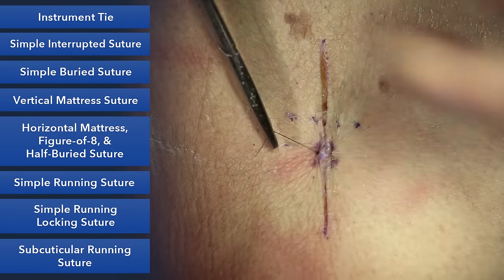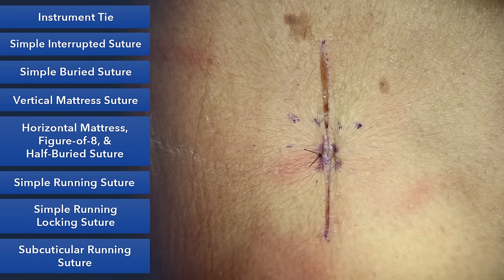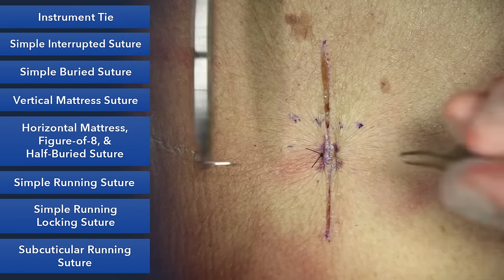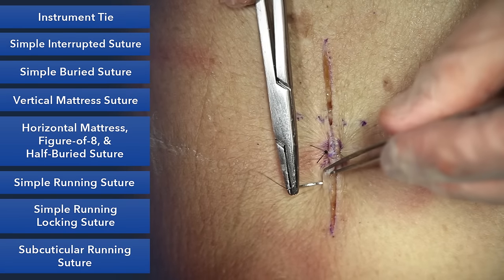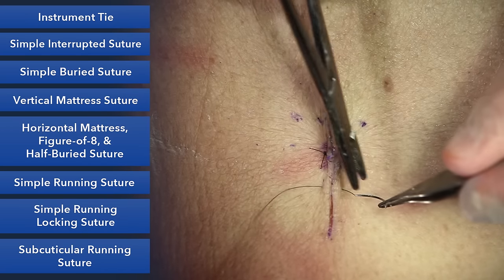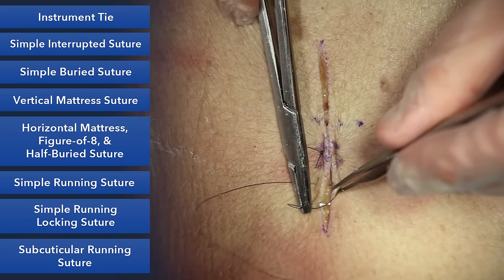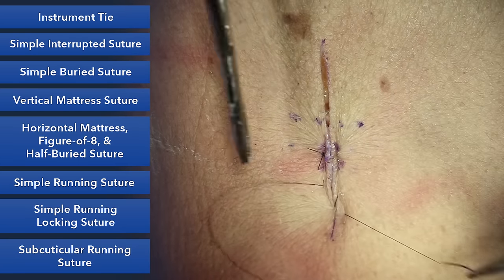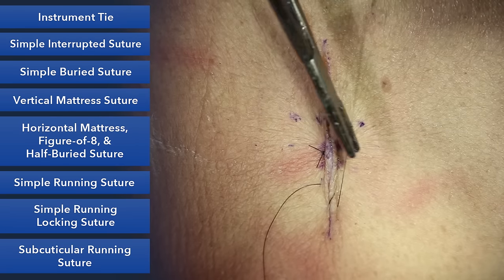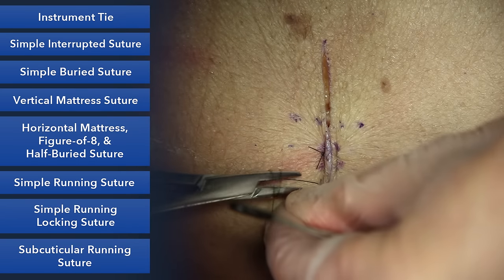So that's one example of a horizontal technique. A variant of this is the figure of eight suture. The figure of eight suture is the same distribution. You take your simple bite and your simple bite, but rather than turning the needle around, you move on and take your next simple bite and simple bite. What that does, when you tie this, it'll make a small little eight, and that's why it's called a figure of eight suture. The advantage of this, again, is speed.